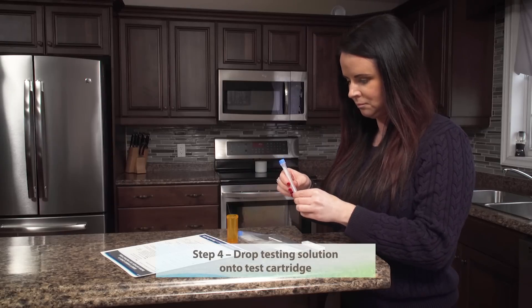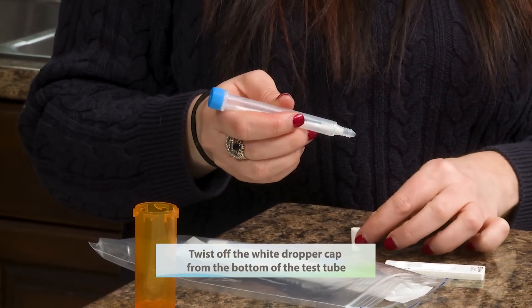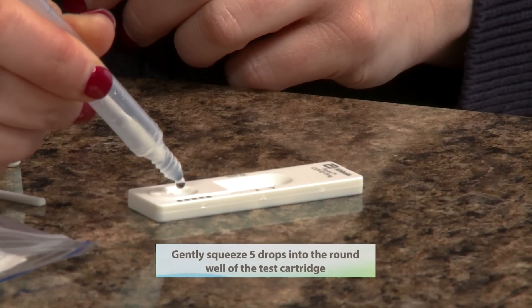Step four: drop testing solution onto test cartridge. Twist off the white dropper cap from the bottom of the test tube. Gently squeeze five drops into the round well of the test cartridge.